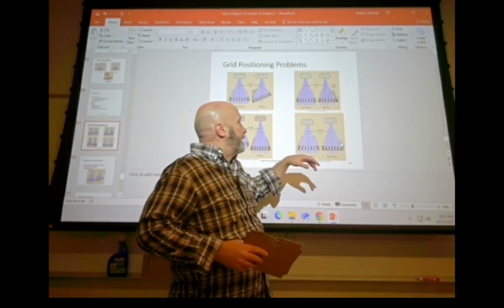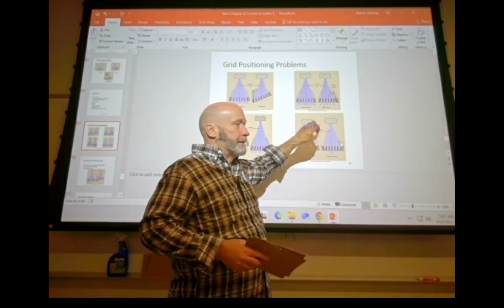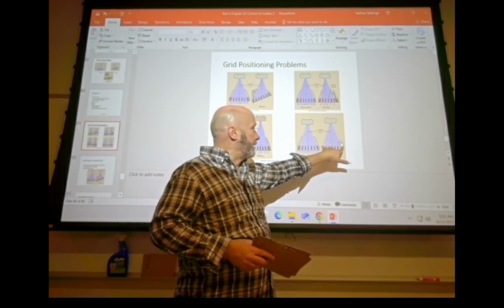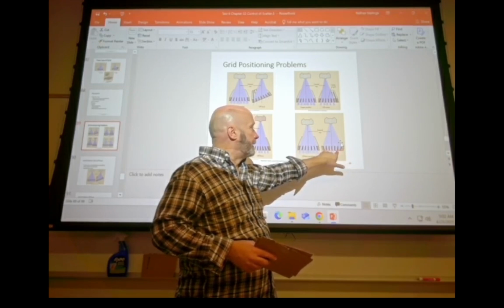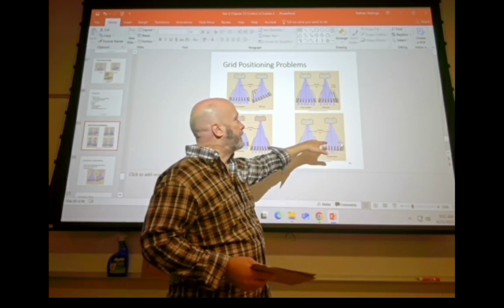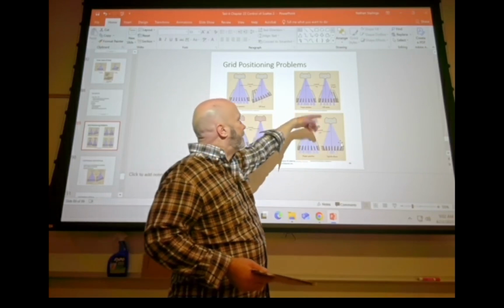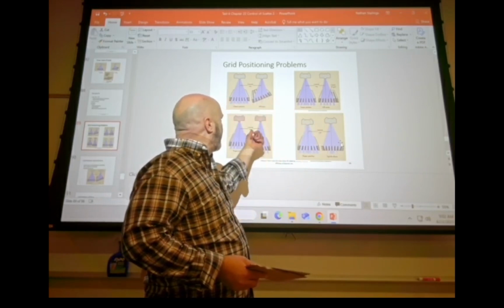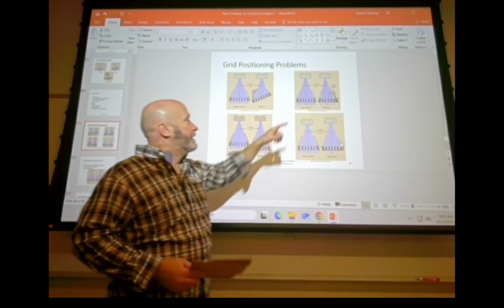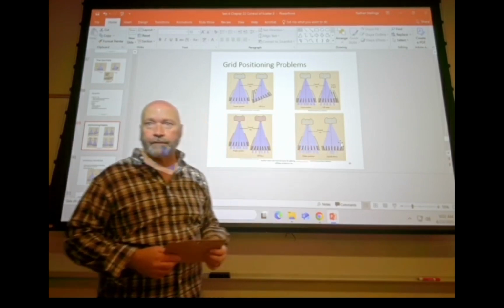If you have an upside down grid, or an inverted grid, this is going to be specific to any type of focus grid, then you're going to have very bad grid cutoff almost immediately. You'll have good density right in the middle, and the rest of it, you're just going to have grid cutoff. And then off-center grid, again, if you're looking at a focus grid, if you off-center a little bit, you're going to have some grid cutoff as well. That's not going to be as bad as this. This is not going to be as bad as that either.